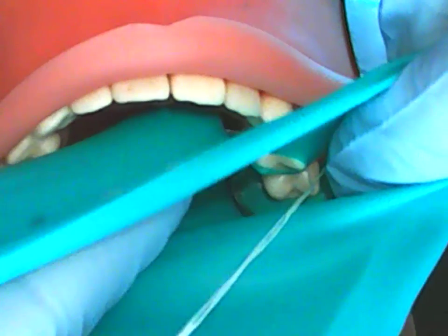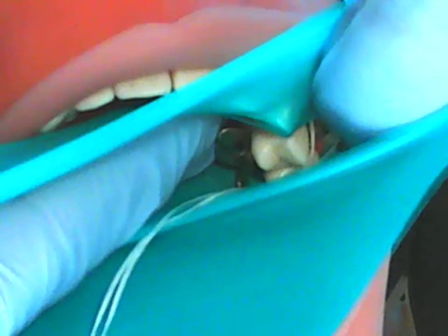Okay, it's through the hole. Now you need to place the dam around the bow and jaws of your clamp. So again, get your fingers, stretch that key punch hole across, and open it up a little bit. Using direct vision, you need to get over that bow, and I would just continue with the jaws as best as you can.